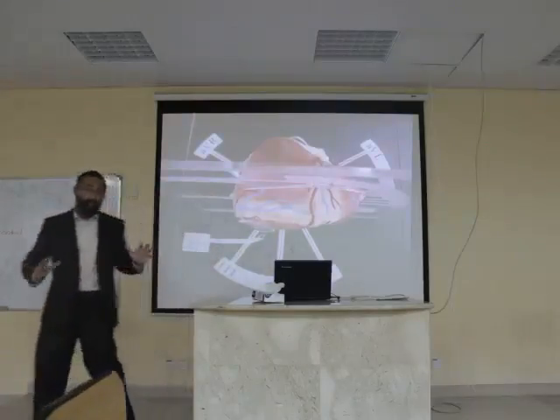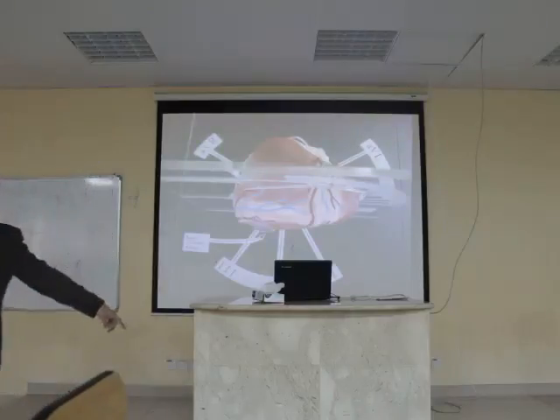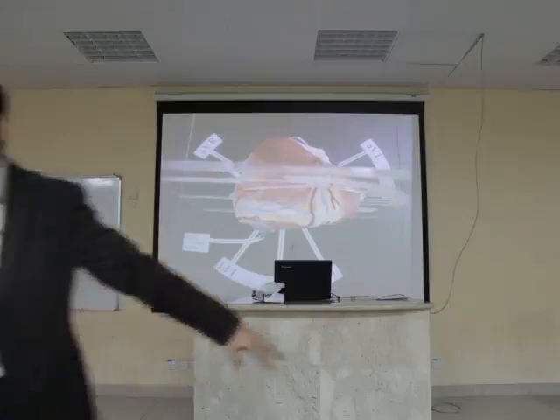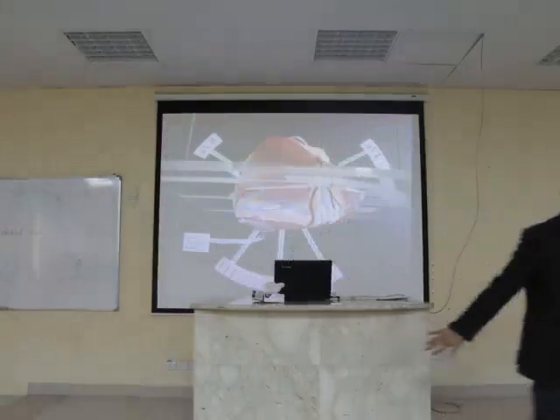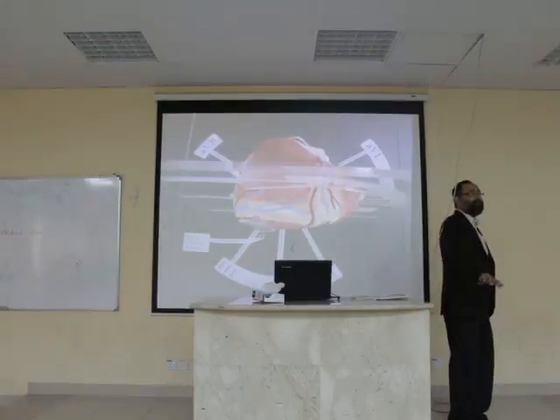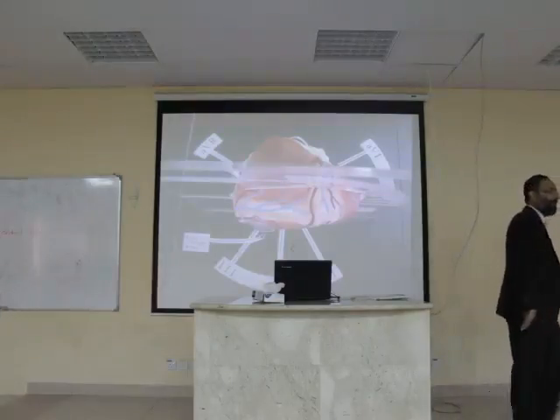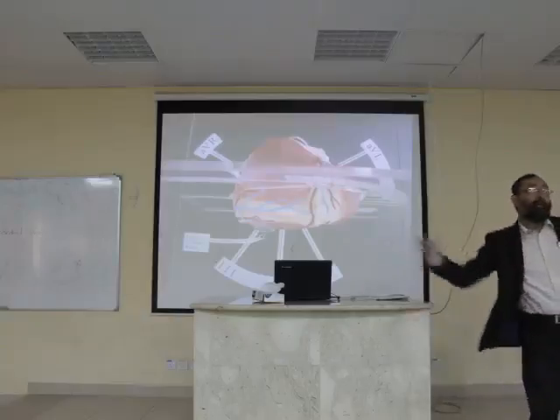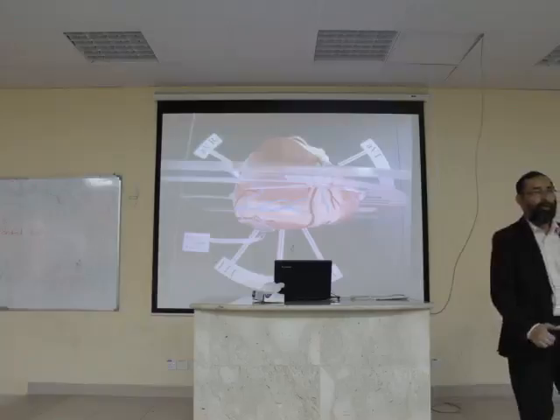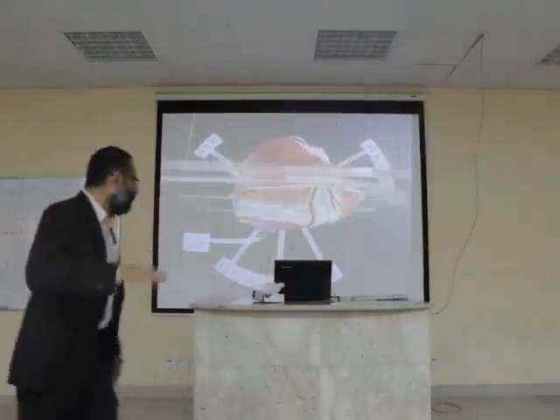So now you have approached from different areas and from different angles. V1, V2 is for septum. V3, V4 is for anterior. Okay. V5 and V6 for? What about lead one? Here, this side. What about AVL? This side. What about the inferior surface of the heart? Correct? And what about the right atrial chamber view? AVR. Cannot use very much.